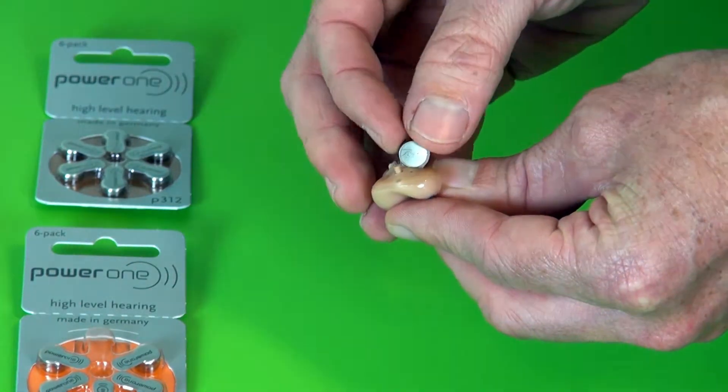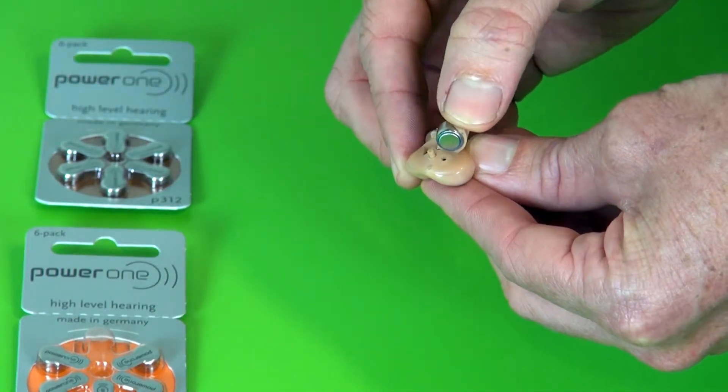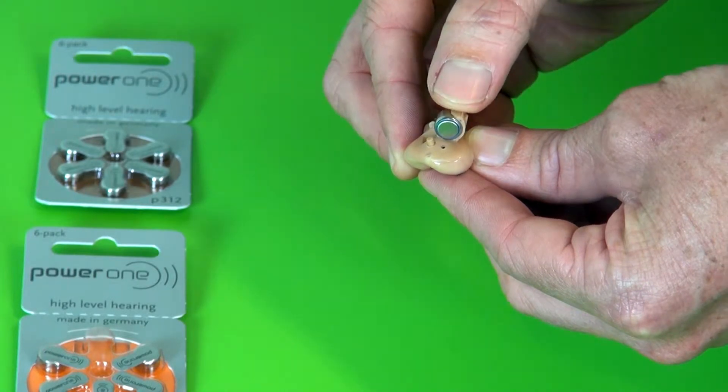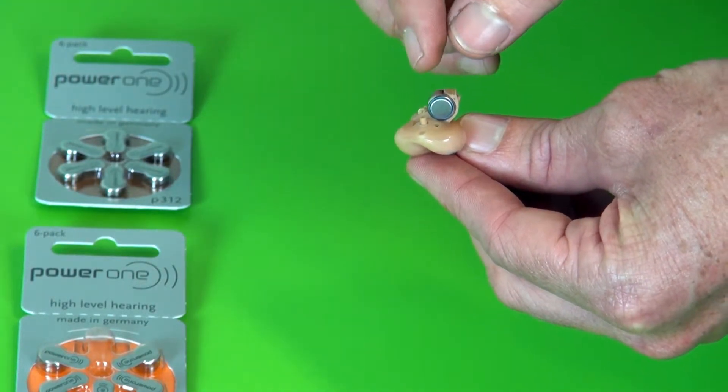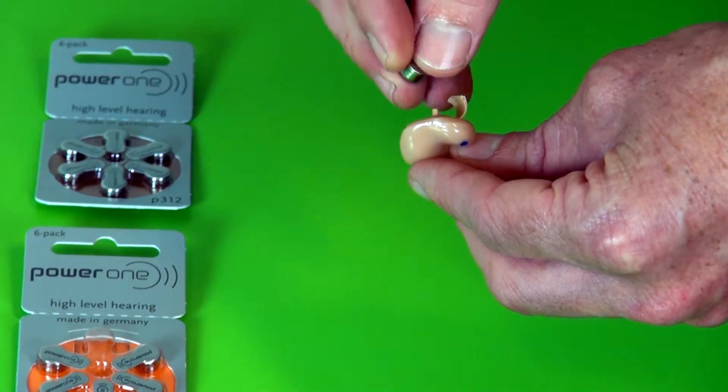If you put the battery in the wrong way, the battery door won't close. If you force it you are more than likely going to break the battery door. So just pay particular attention to make sure the battery is in the right way.